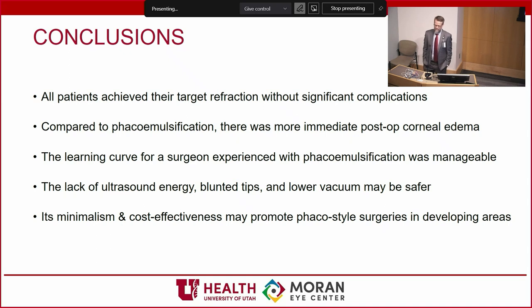But for acute studies with the model that we've used, it's very good at picking up. So we could compare this to a standard ultrasound. We could do the vital staining, and we'd be able to tell a difference right away. And so I hope we can come up with a way to make this work, because that's really critical.